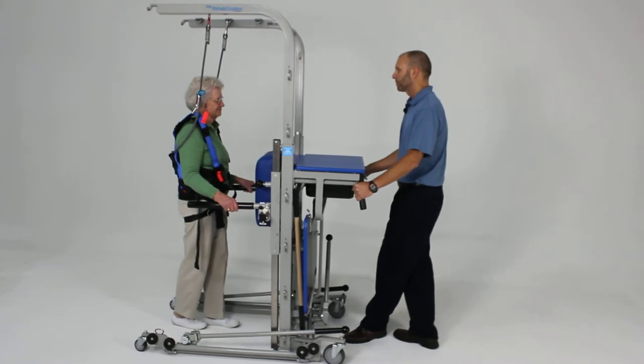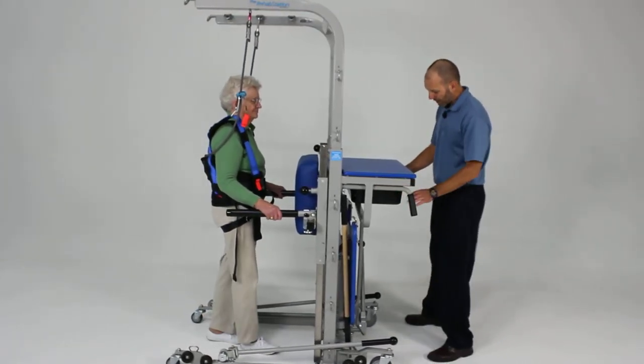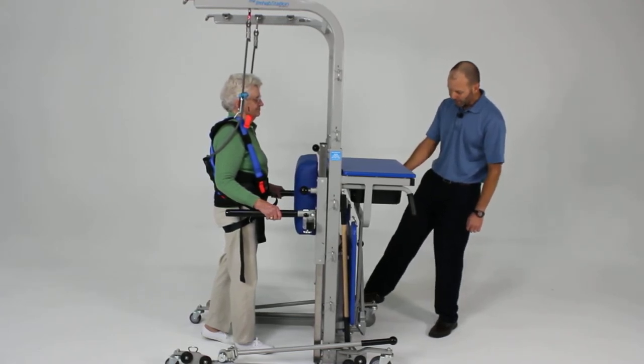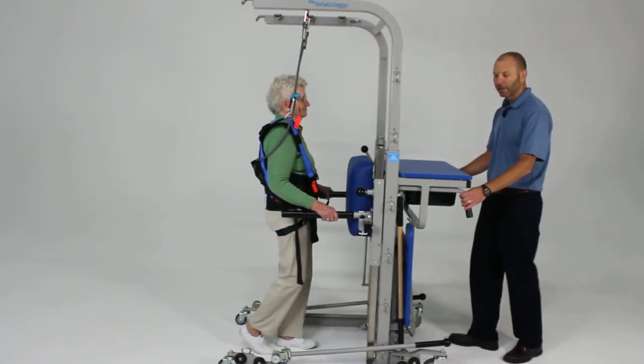Step forward. One of the things you can also do is there's a directional caster on the front here, which can also help with that. You can lock the directional caster, and that helps with keeping it moving in a straight line.